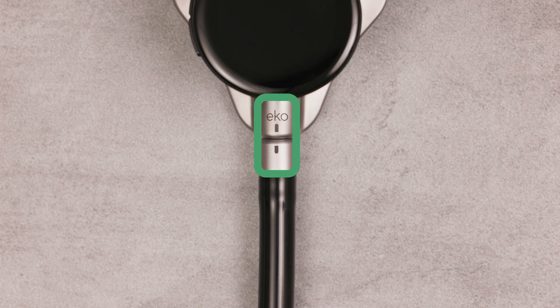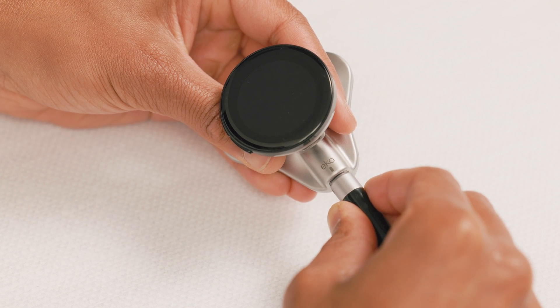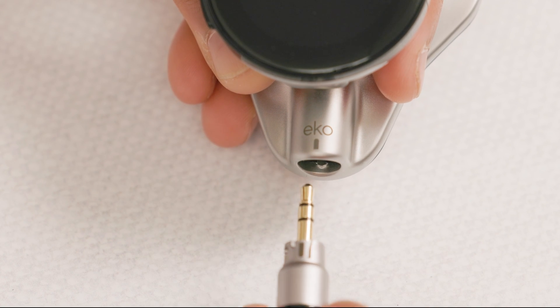The mark on the chest piece socket should align with the left side mark on the earpiece. To detach the earpiece, twist it counterclockwise with a quarter turn until it unlocks.